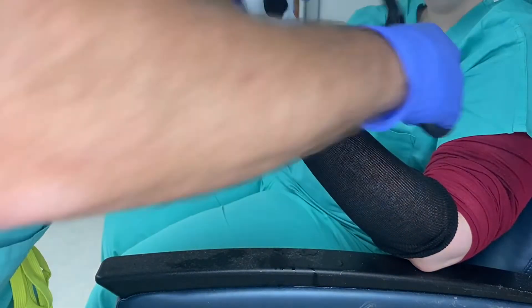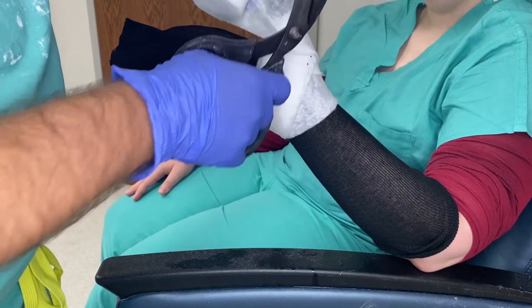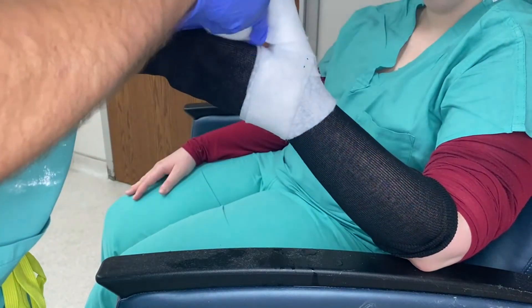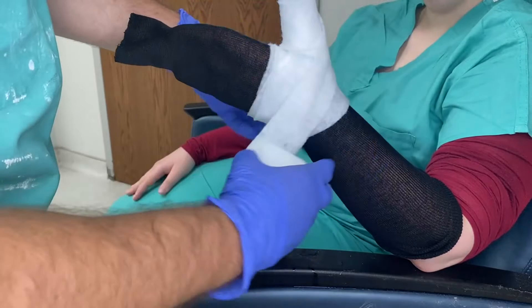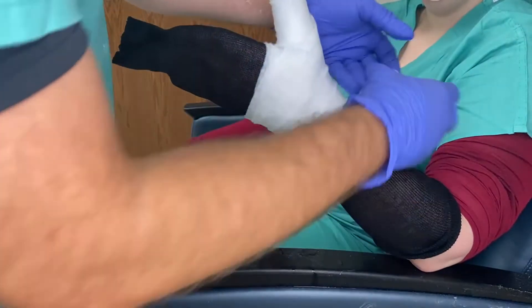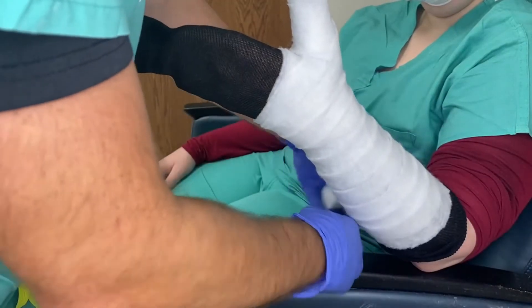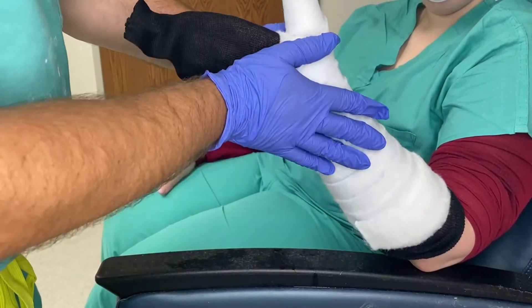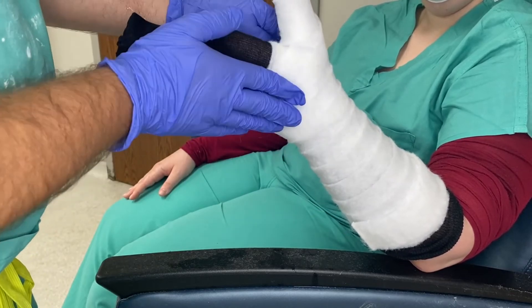Go around the hand with a three-quarters cut. If the patient has a long thumb, you can go around the thumb a couple of extra times to provide some additional padding. What you want is nice, even layers — you don't want it too bulky. Go down the arm at 50-50 overlap, down to about three-quarters length of the arm. Go around four times; casts don't need a lot of layers. As long as you have two even layers throughout the whole cast, using the 50-50 technique, you can go straight to fiberglass.